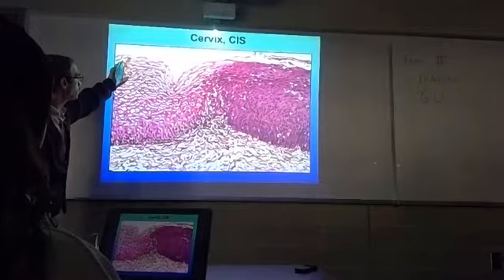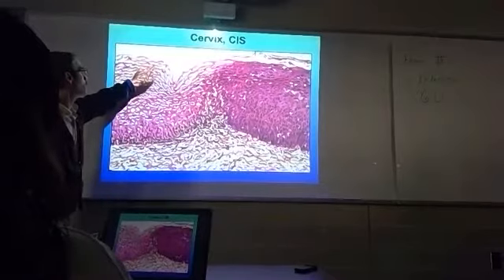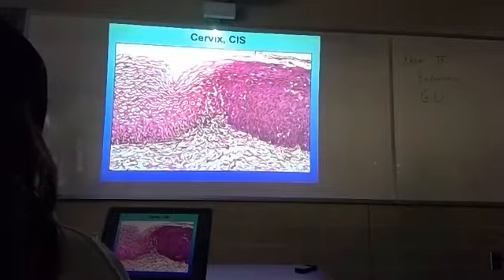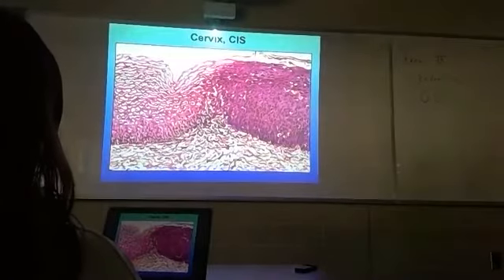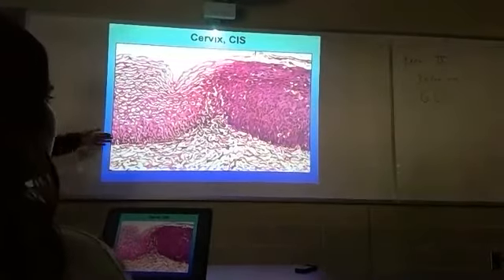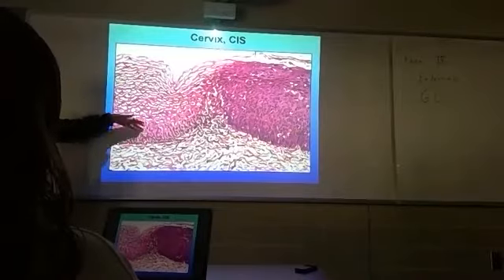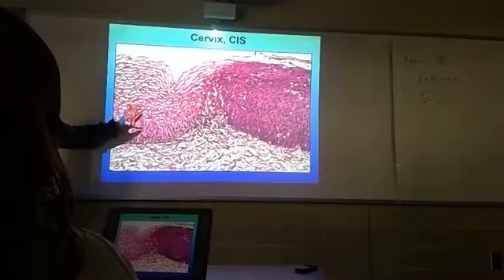By the time they get up to the superficial layer, they have very small nuclei, big cytoplasms, and again, the NC ratio is much smaller. All of that is good indication that this epithelium is maturing properly. We say the epithelium matures properly because the cells within the epithelium are maturing properly.